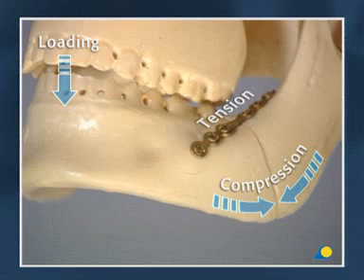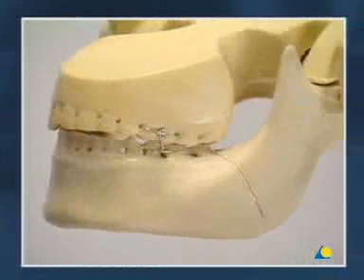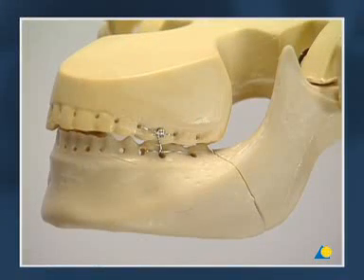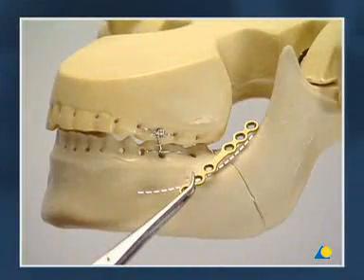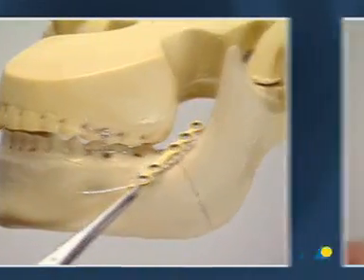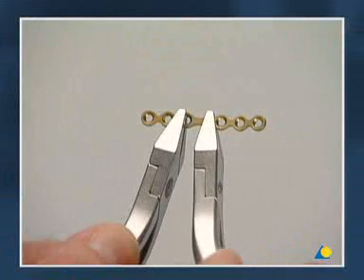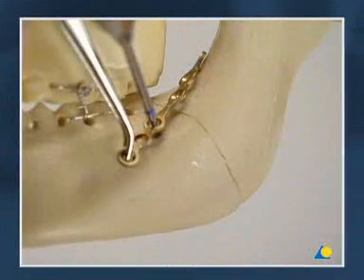Here are the main steps once again: reduction of the fracture and MMF with Ernst ligatures; adaptation of the 6-hole 2.0 mandible mini plate; adaptation of the plate and fixation of the plate to the oblique ridge.